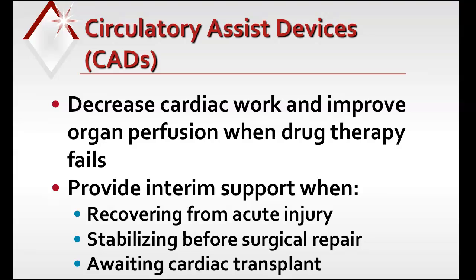Post-cardiotomy, for example, where they open up the chest. Another one is when a patient needs to be stabilized before surgical repair of the heart. So let's say that patient had a ruptured aorta or something like that. It would be able to stabilize them before they had their surgical repair.